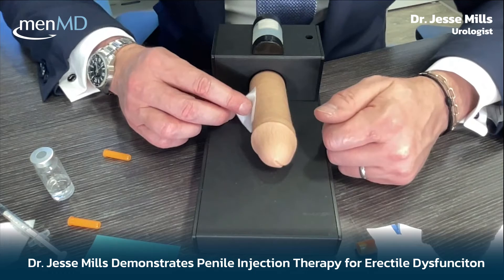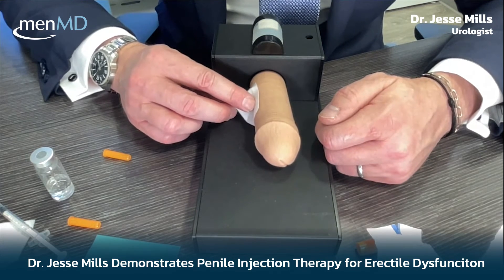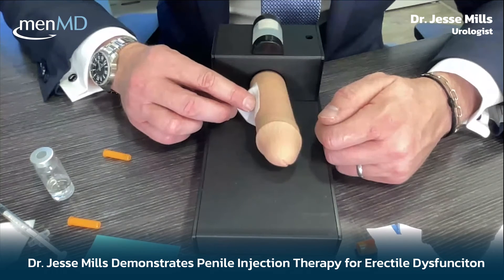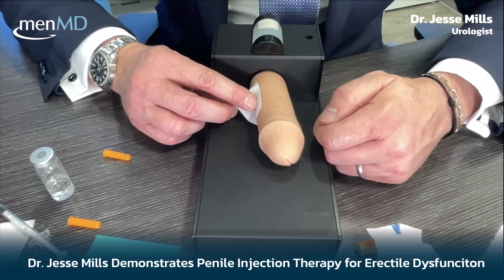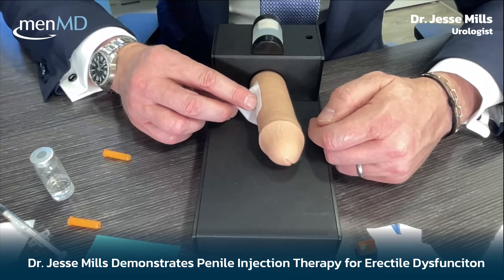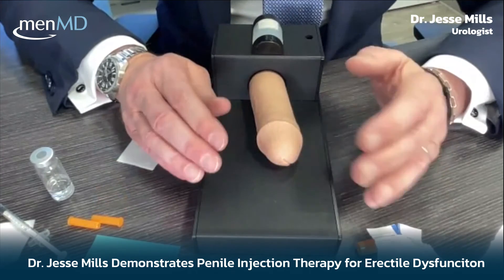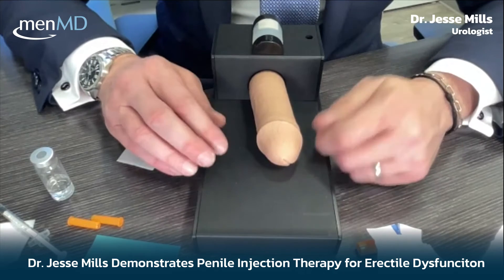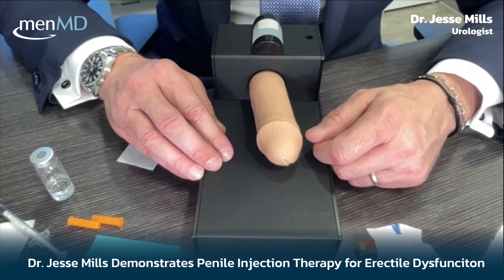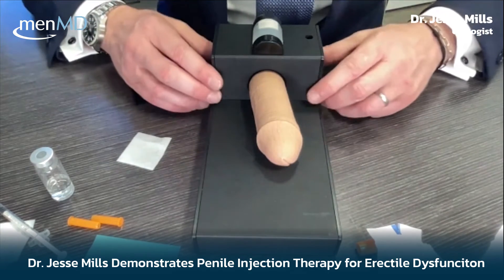After the injection, wipe the area or hold light pressure on it. This is especially important if you're on blood thinners — even aspirin — as you may bruise more. Heavy-duty blood thinners can cause significant bruising, but holding pressure for about 90 seconds keeps bruising minimal. Being on blood thinners doesn't disqualify you from injection therapy. After cleaning up, simply wait — this is a great time to engage in foreplay, because your natural brain will take over as you become intimate.